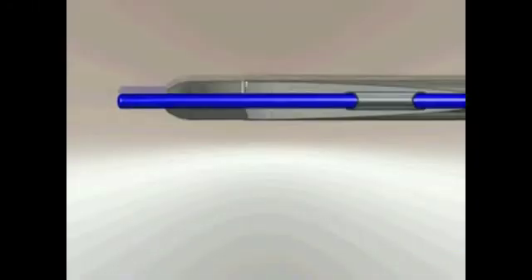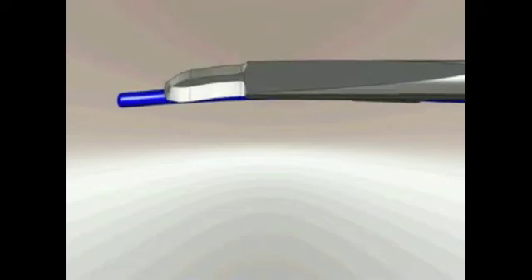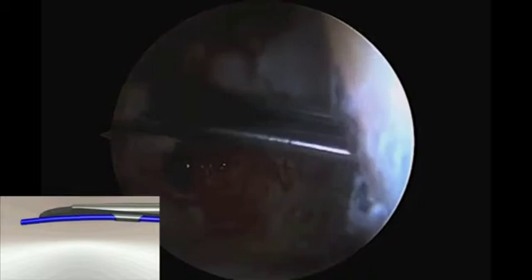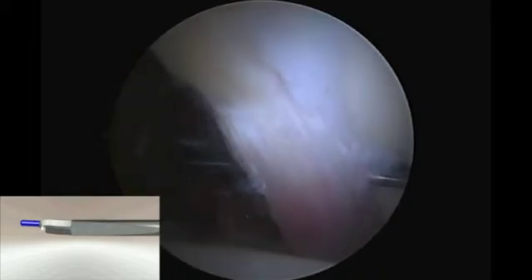The cannulated banana knife from Smith & Nephew is designed so that the tip of the knife corresponds to the nitinol guide wire. The wire is fed through the cannulated knife and the knife is positioned on the peripheral side of the labrum, superior to the wire, ensuring that the maximal amount of labrum is available for fixation.